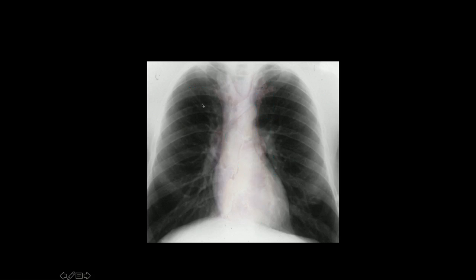Okay. And then if you're coming from above, so right IJ, SVC, where does this look like to you? Yeah, it's too high for the PA. The PA would be down here, so that's the innominate. And if your catheter then goes this way, you're in the lung now, where are you? That's the pulmonary artery, so either you have a Glenn or a Fontan, or you had a partial anomalous pulmonary venous return and you're in the pulmonary vein. But they would give you some clues. This is typically RPA post-Glenn, and this is LPA post-Glenn.